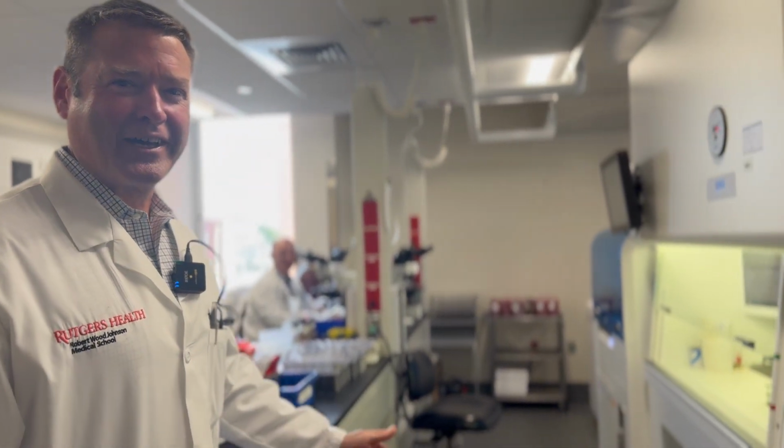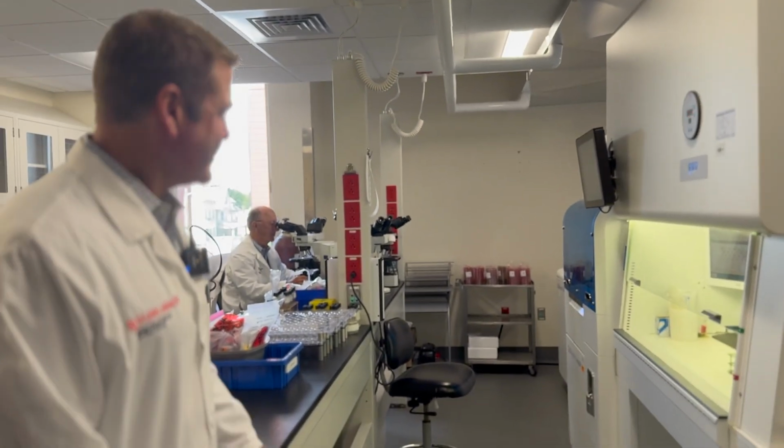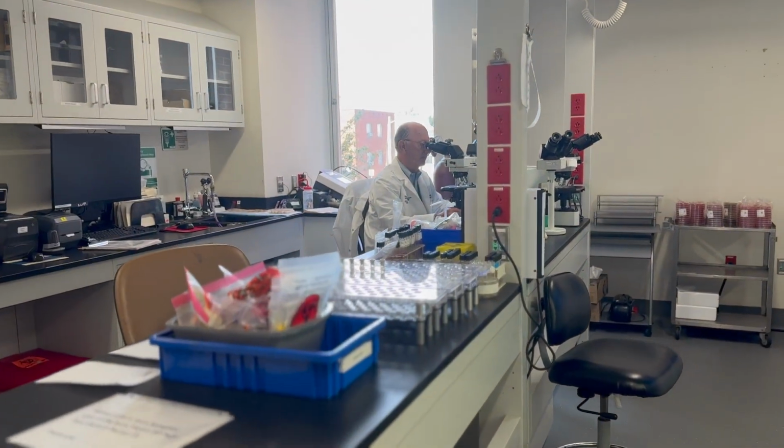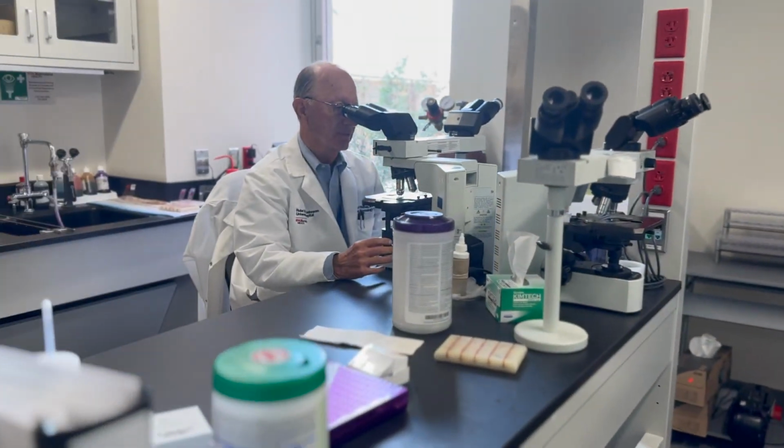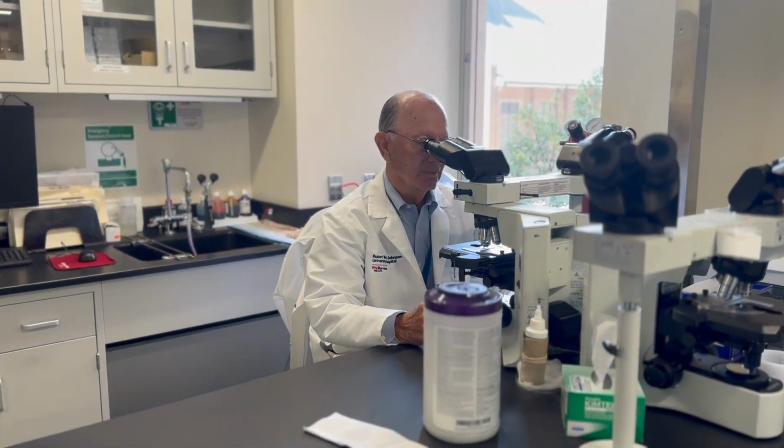State-of-the-art microbiology lab. I'm going to take you for a tour here and show you what a specimen goes through as it comes to the lab for processing for bacterial culture. So we'll start over here where we read gram stains. Specimens that come in for processing in the laboratory are put on a slide, and a gram stain is read at these microscopes. You can see Dr. Weinstein here diligently working away.